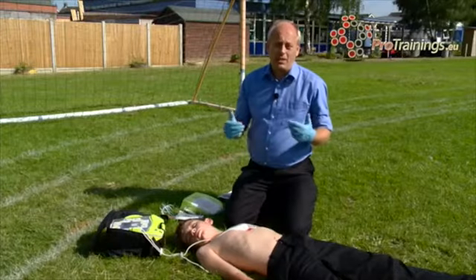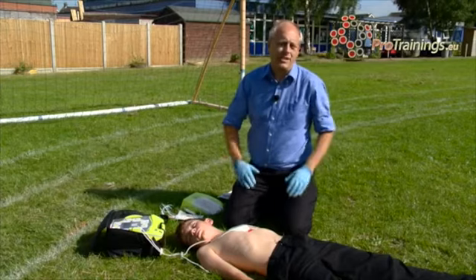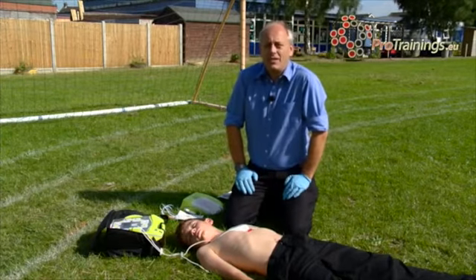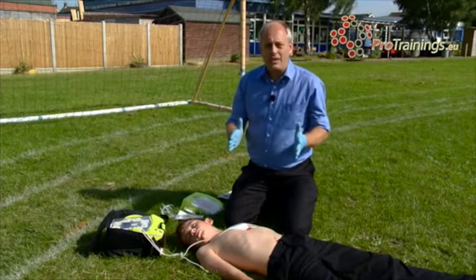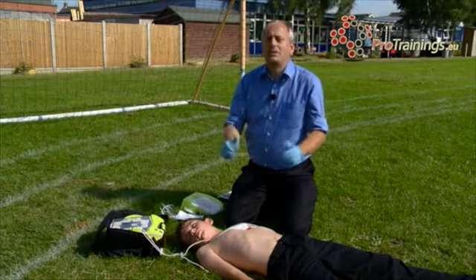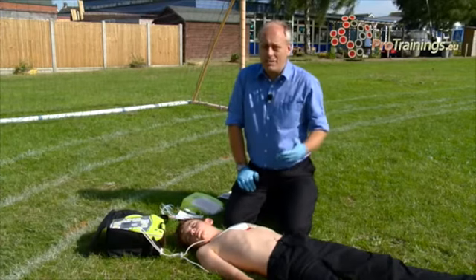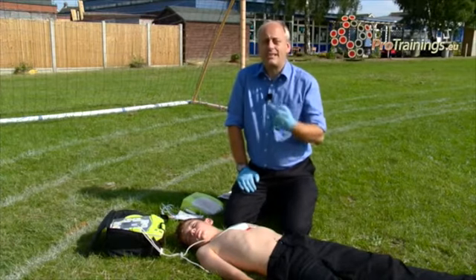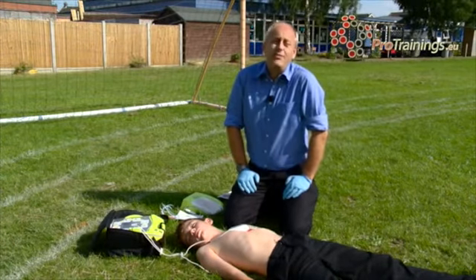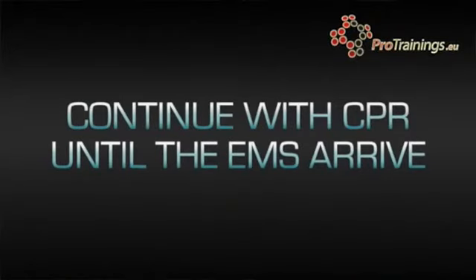Deaths do happen with children and they do go into cardiac arrest, and having AED units available in schools and other play centres where children are going to be is very, very important. So if you've got an AED available, then you would use it. They would talk you through everything and guide you through exactly what to do. If you haven't got an AED available, then you need to find out if there is one. It may be you've just turned up at a school and you don't know whether they've got an AED there or not, in which case ask or get somebody to go to reception and find out. If not, you're going to have to wait till the paramedics arrive. So in that instance we would just carry on with the CPR. Keep going with the CPR until the emergency services arrive.